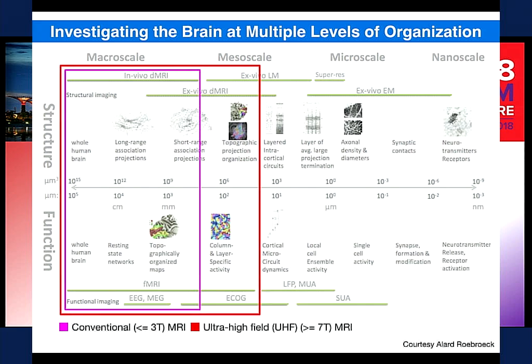And for that, we push, in our lab, but also many other labs at the moment, we push the limit of functional resolution down to sub-millimeter space. And that little bit, that looks not much, but it's quite difficult to achieve with fMRI. But the benefits are huge, because we suddenly not only see areas and networks, but we see also structures inside the depths of the cortex, and also tangentially along the cortex. We see within the same area feature codes, like representations which have representational information.